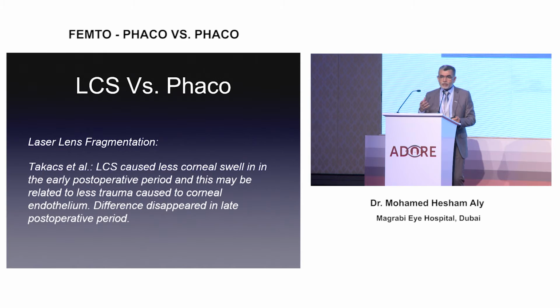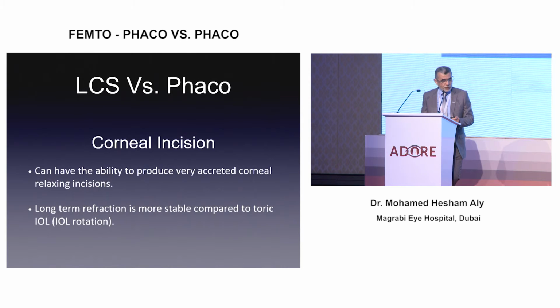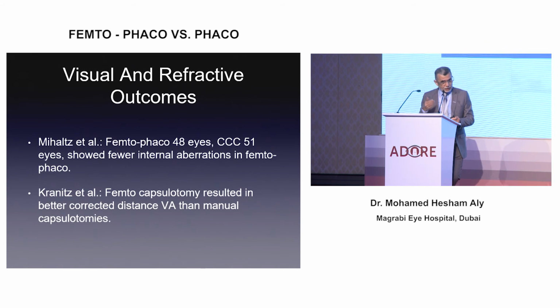I know some of us are very skeptical about FEMTO phaco, but actually, at the end, this is the future of cataract surgery. FEMTO is the future, especially as it improves lots. The corneal incision, I agree with Dr. Ammar, is not much superior, but at least you can design your planned incision. The outcomes in this study show that it's more superior.